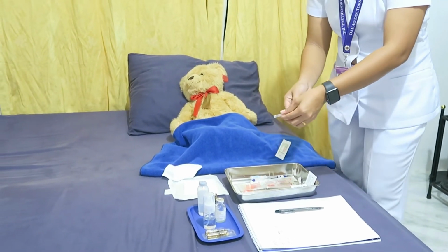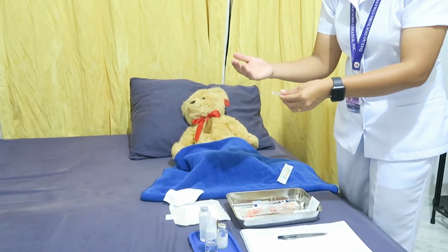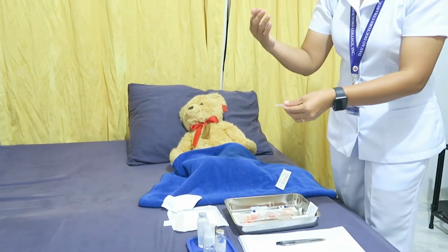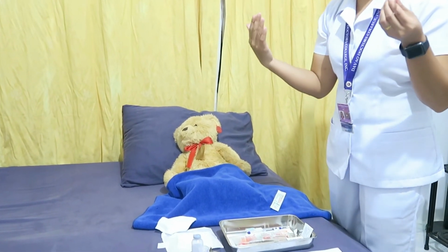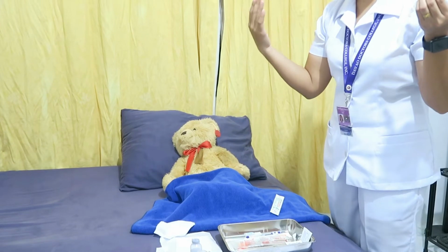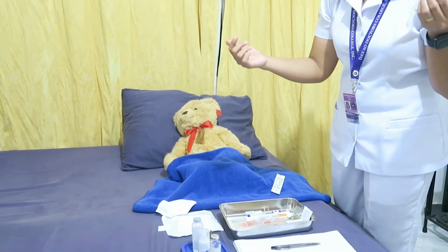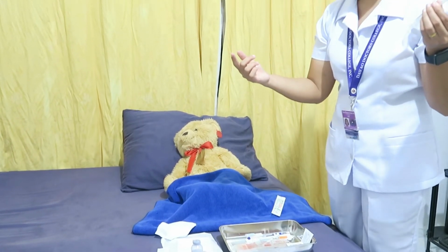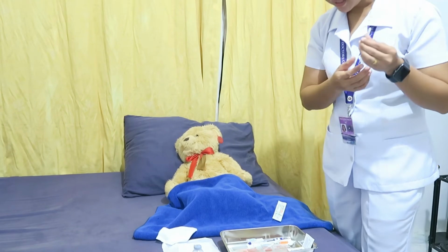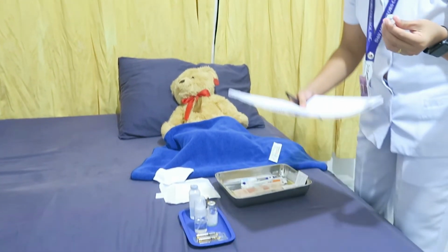Then, if giving an injection, replace the filter needle with a regular needle, tighten the cap of the needle, and push solution out of the needle to the prescribed amount. So, after that, check the chart. This is because the chart of the patient is more reliable than the medication ticket. Then, the next is to check the doctor's order.